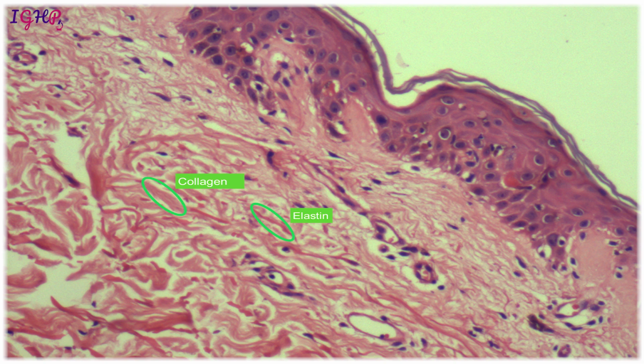Now let's see an example. So this is a histology of skin, and what do we see here? We see the epidermis, that is the squamous epithelium, which is lying on the basement membrane. You do not see any vessels within the epithelium, whereas you see a good amount of connective tissue stroma beneath the epithelium. Now this connective tissue stroma is going to constitute the connective tissue of the dermis.